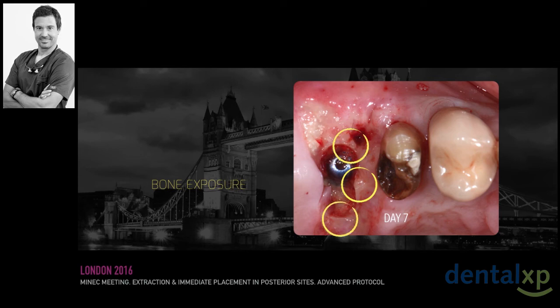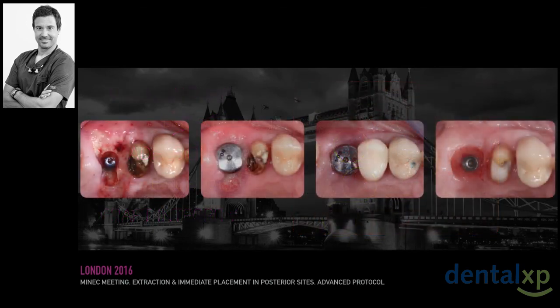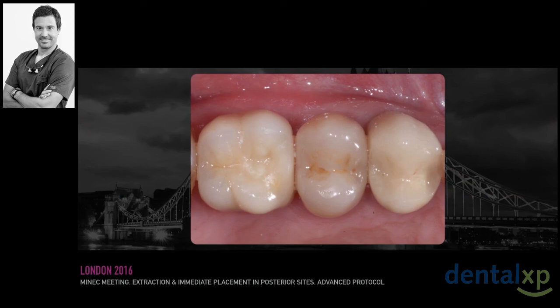But I also found good things that happened. Agglutination of my particles into the sockets. Adhesion of my particles. Graft integrity. And I saw no dry socket. Let me say that using growth factors, in this case, prevented me from having a dry socket, graft infection, and soft tissue necrosis in a non-cooperative patient, as you could see. I must agree with Dr. Anitua by saying that the use of growth factors helped me to succeed.